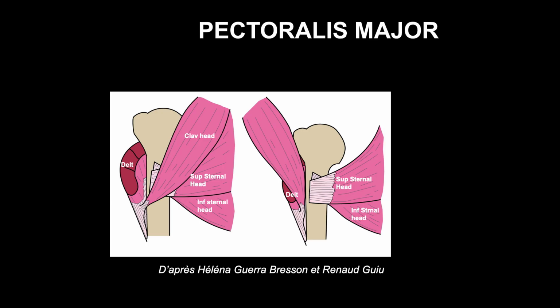There is a prominent U-shaped tendon with the base pointing downwards, representing the upper sternal bundle in front and the lower sternal bundle underneath. The clavicular bundle remains muscular for longer and is often visible in front of the main common tendon of the sternal heads.